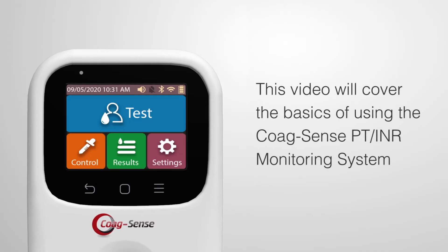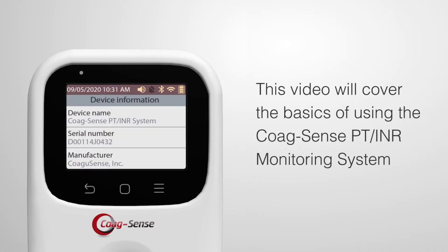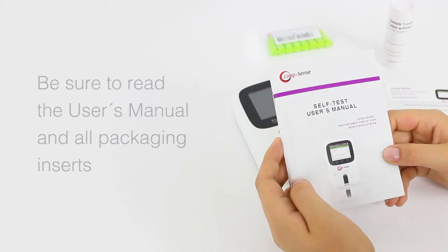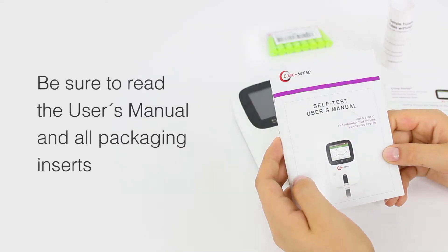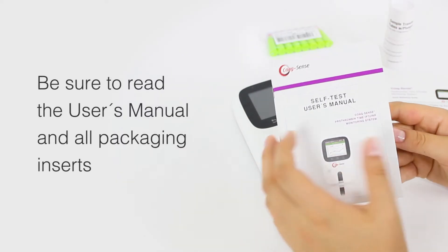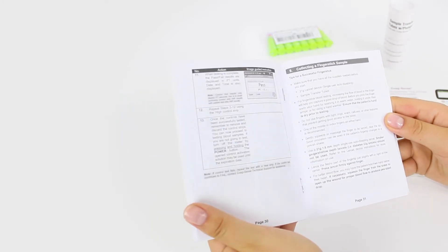This video will cover the basics of using the CoagSense PT-INR Monitoring System. For complete instructions, be sure to read the user's manual and all packaging inserts.